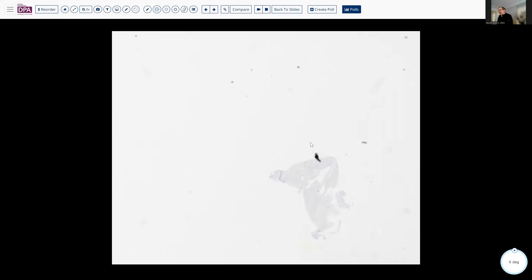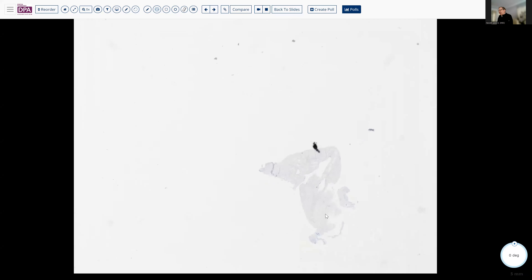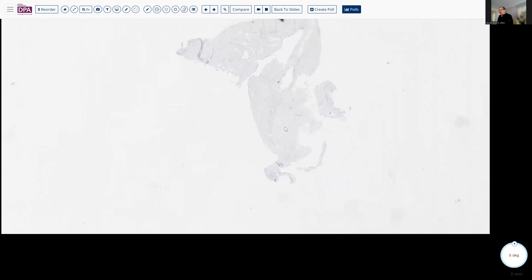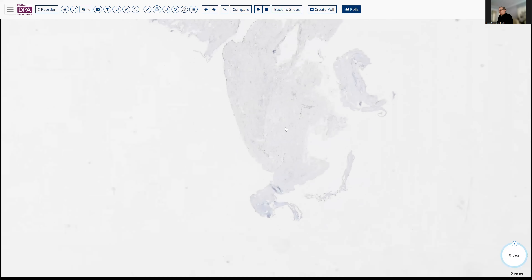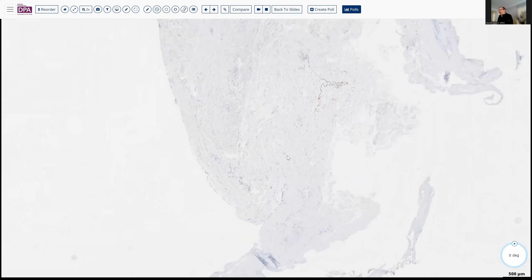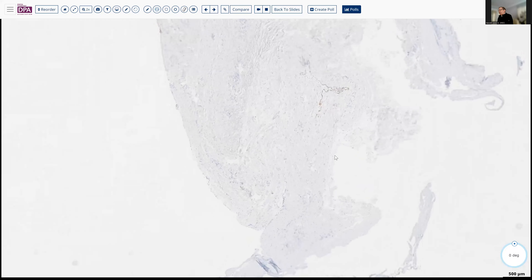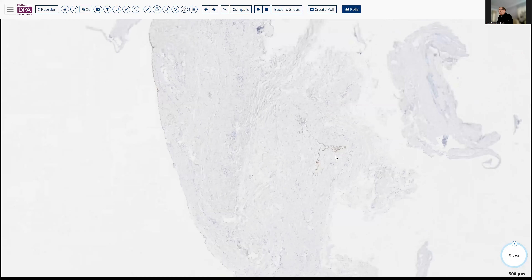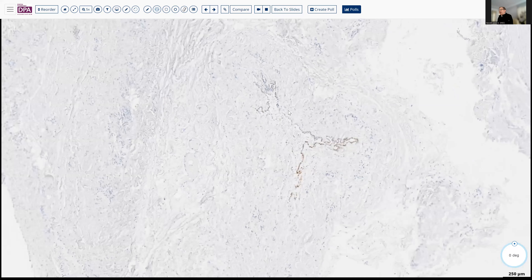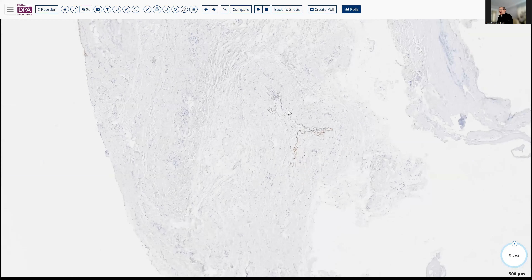Here we can see the calretinin stain. As you can see, it has pretty well exhausted any residual areas. We are picking up some of the normal mesothelial cells, but we have exhausted the sample.